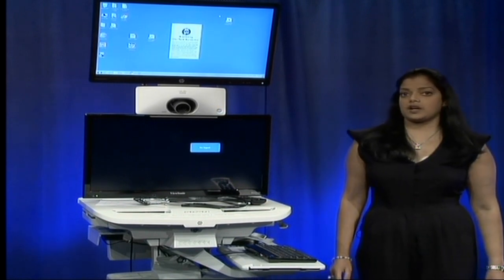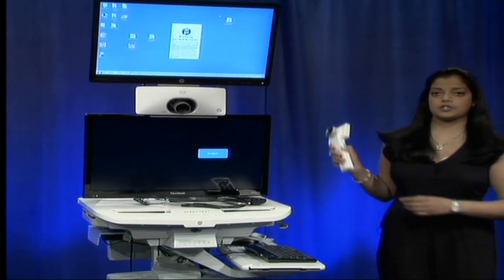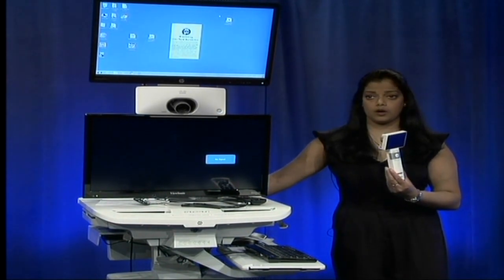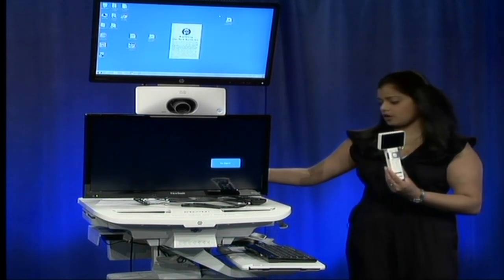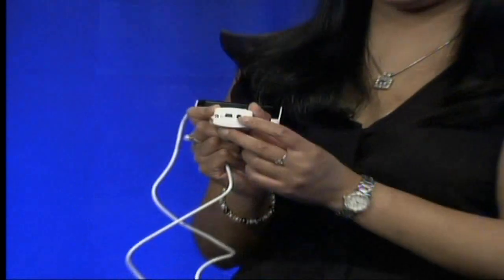We're now going to operate the handheld camera. Take the handheld camera out from the charging cradle behind the monitor. Take the cord that is located in the back basket of your cart and connect it to the bottom of your camera.